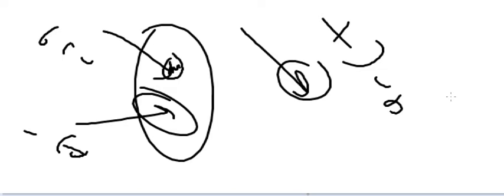Then we can use the Hounsfield unit to determine what this is. Is it fat? Is it bone? Is it metal? Is it soft tissue? Is it air? What is it? So it's very helpful and beneficial, this contrast resolution thing.